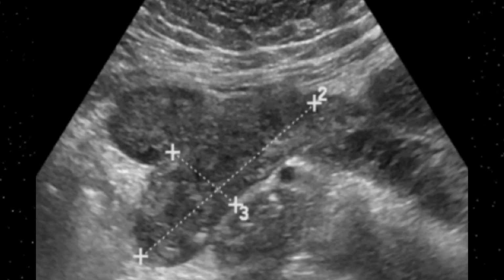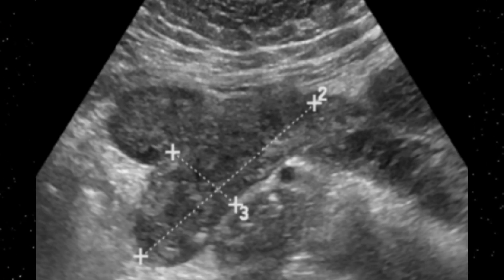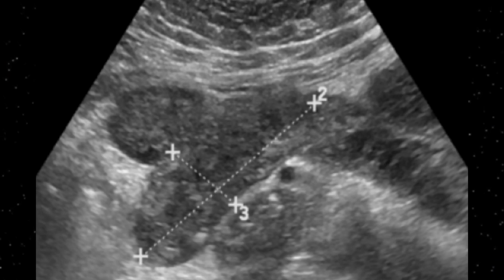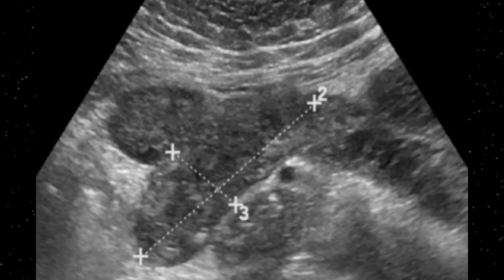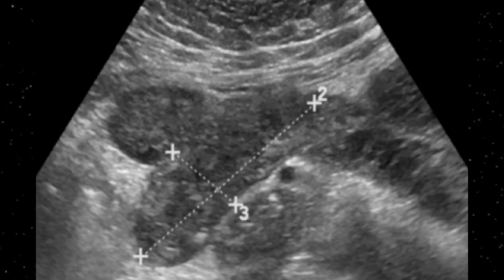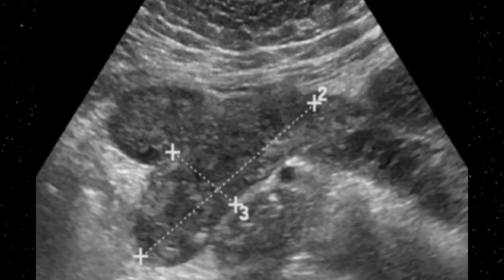And besides this, as I mentioned, there are two techniques. One is the compression technique, and the other is the ultrasound Doppler signal. Both techniques can easily confirm it. And another point is, even with proper preparation, sometimes because of bowel gases you may not be able to see it. But if you perform a transvaginal scan, these features can be easily picked.